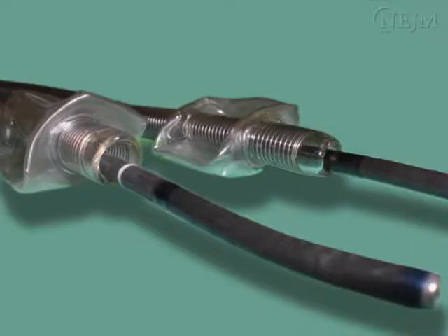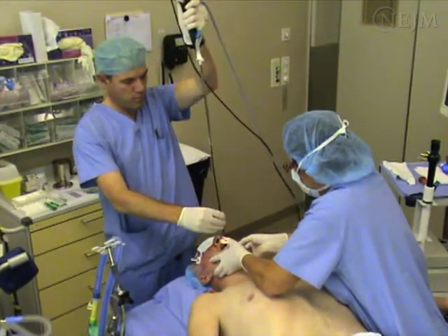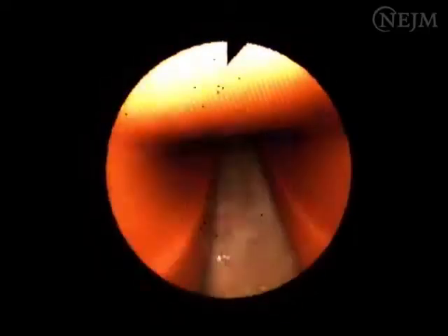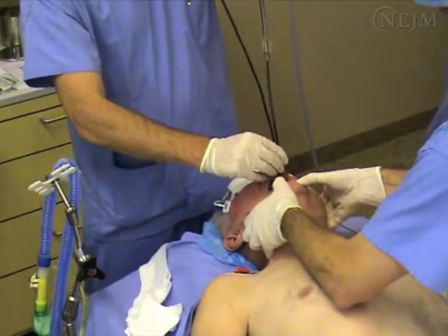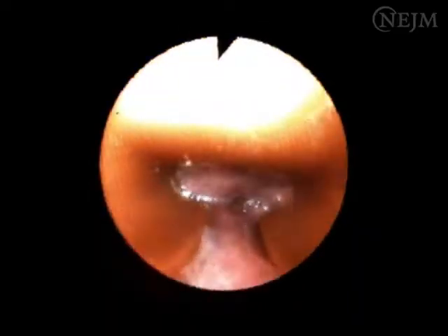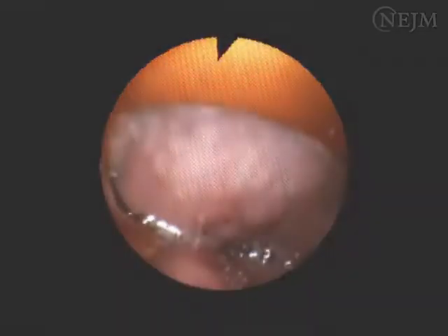It is very important to minimize the gap between the tube and the fibroscope, since a small gap decreases the likelihood of difficulty when advancing the tube over the fibroscope, especially in the posterior arytenoid region. When performing oral fiberoptic intubation, be sure that the chin lift and jaw thrust maneuver is adequate and be certain that the slit oral airway is the right size. In general, for adults a number 4 slit airway is the appropriate size. If the oral airway is too large, it will obstruct your view through the fibroscope as you advance towards the glottis.